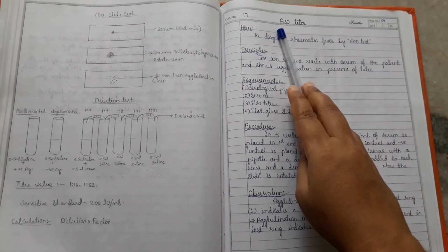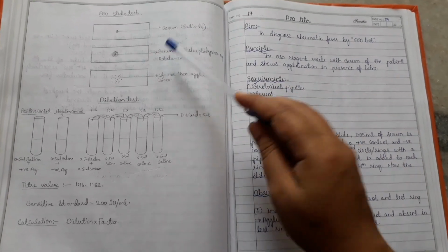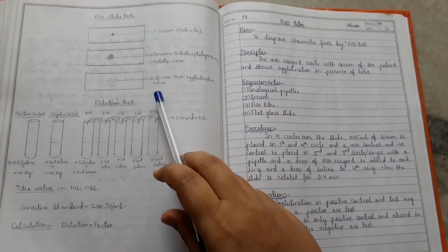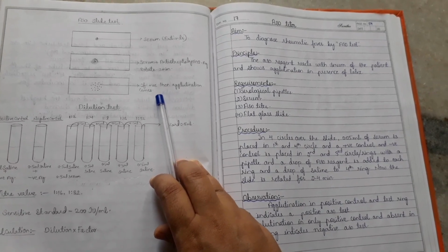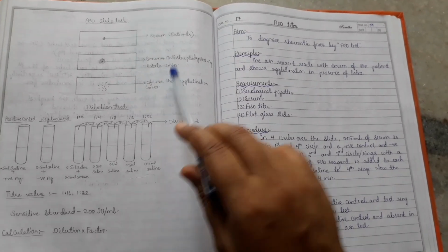So ASO titer is used to diagnose rheumatic fever. This is the slide test. This is the dilution test. It shows agglutination when positive. So this is the method and procedure of a slide test.